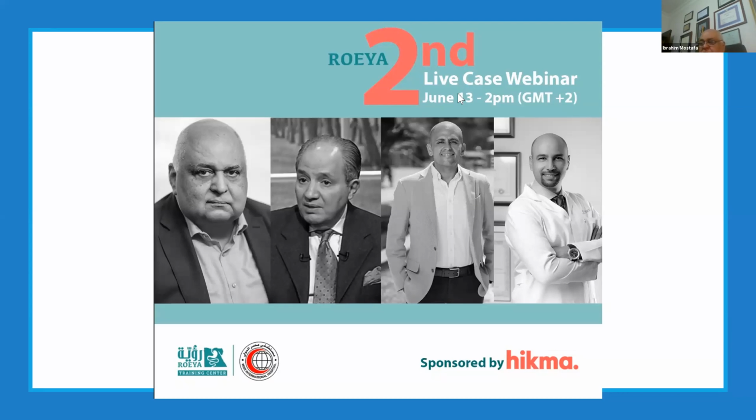But if for some reason the wire goes inside, what will you do? I can remove the wire again and put another wire. About this stent, if you don't see any wire and the wire has gone inside, what will you do? Nothing to do. What's important for me is whether the wire is inside or outside, because normally you catch the wire and you get the stent out.